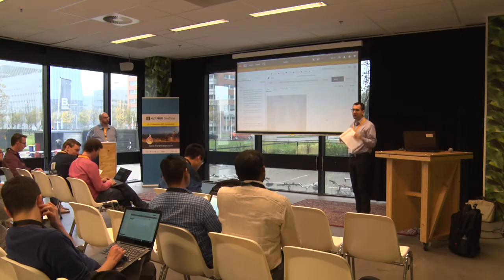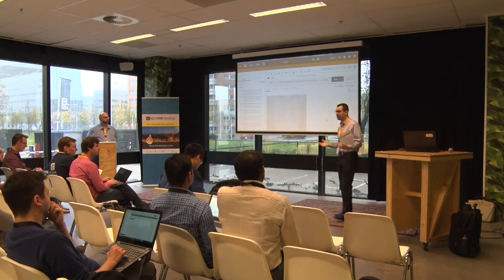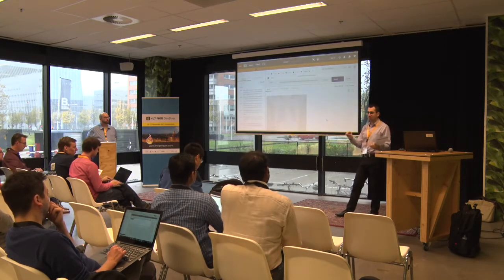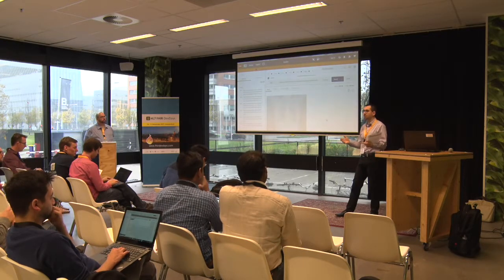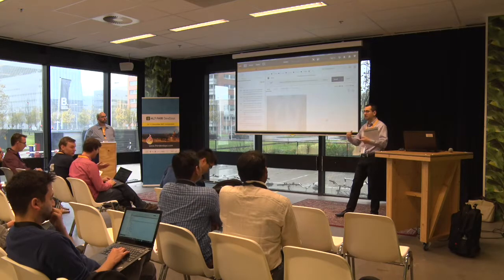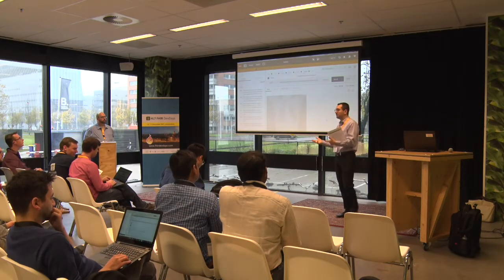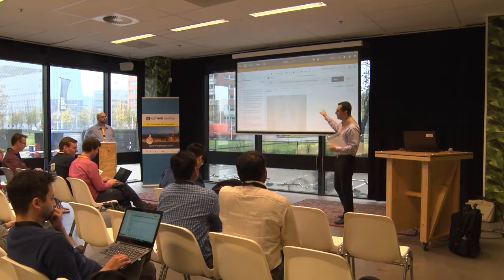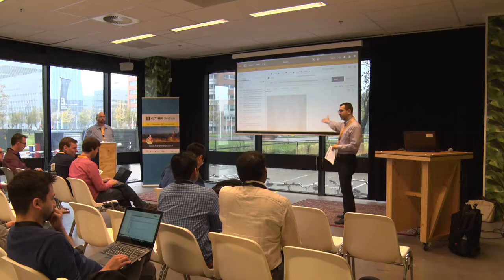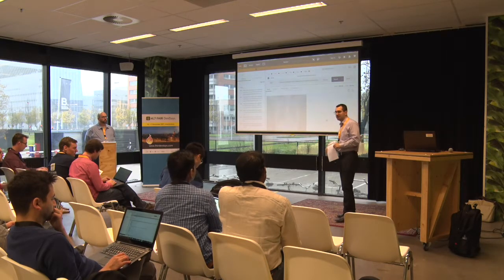Getting the quote-unquote binary data here really involves two things. You can either get the actual DICOM file, but then you're stuck trying to render it because it's a complex file. The pixel data in the DICOM file is not typically stored in JPEG. It's typically a raw format, and usually 16 bits or 12 bits. It's not a usual 8-bit image. But you can ask for a rendering of the image, which is what you're seeing here. So here I'm asking for a JPEG rendering, and I'm getting exactly that.